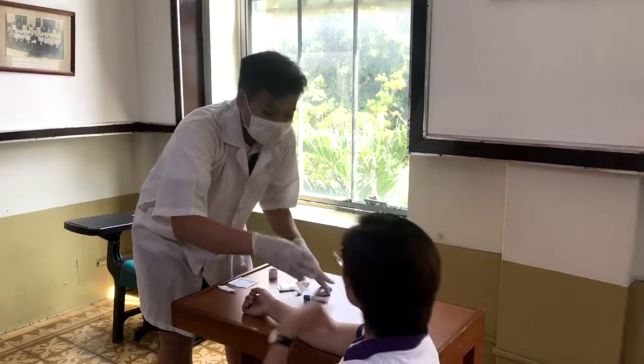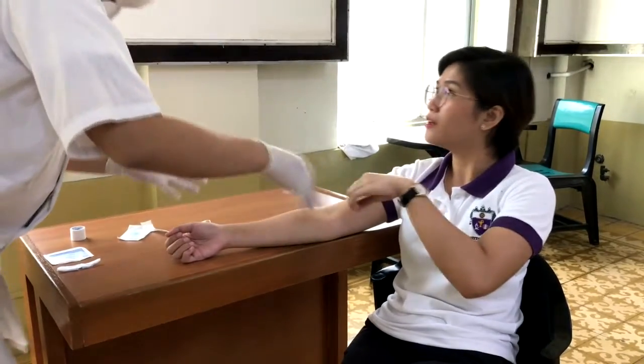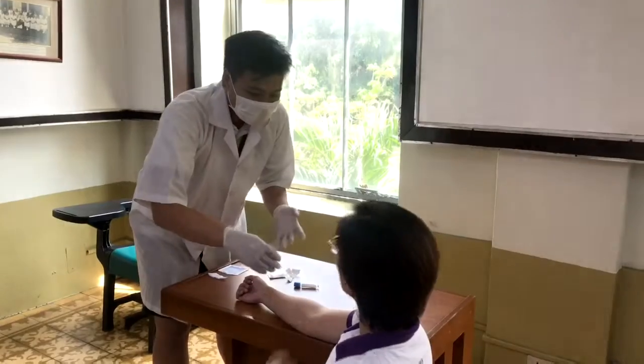The phlebotomist must listen to the patient and hear what he or she is saying. The phlebotomist must also explain why it is necessary to follow the standard procedure rather than what the patient has suggested.